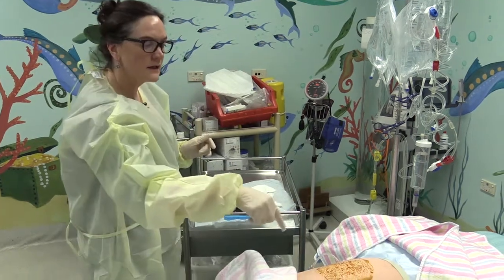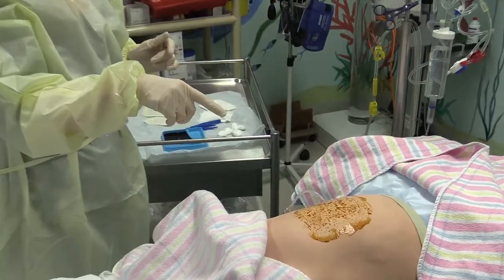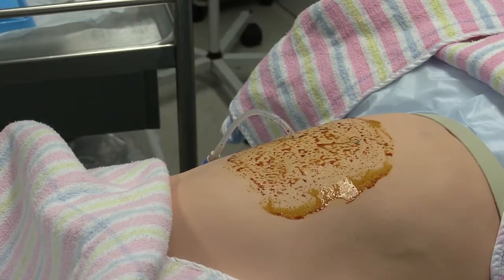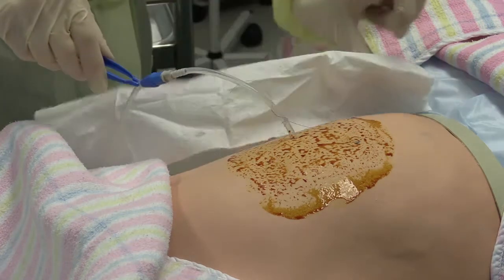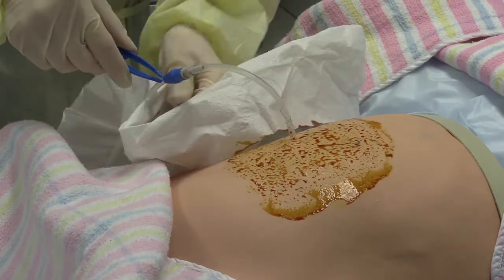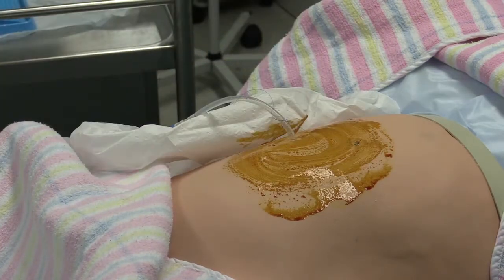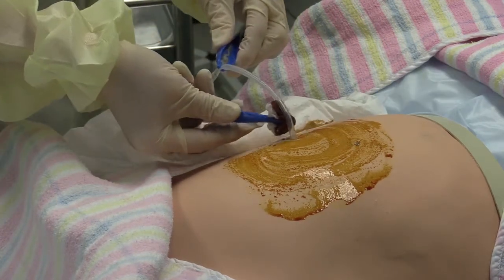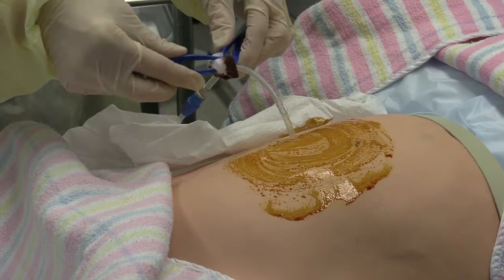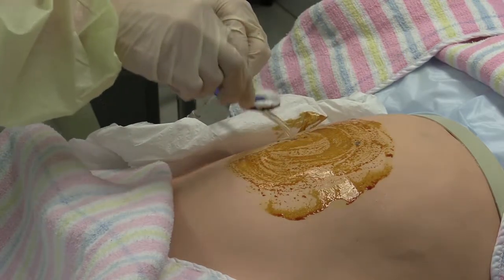The skin and the exit site have already been cleaned with betadine prior to catheter insertion. Just put a sterile towel underneath the catheter, keep it clean. Then I'll clean once more from the exit site underneath and up the catheter. One on the top.